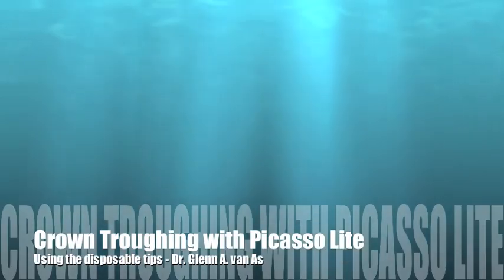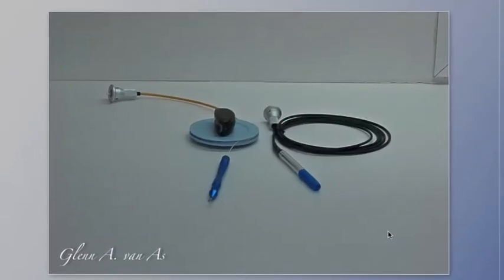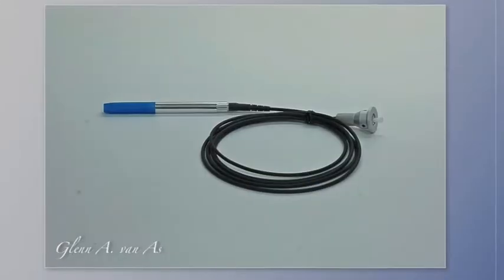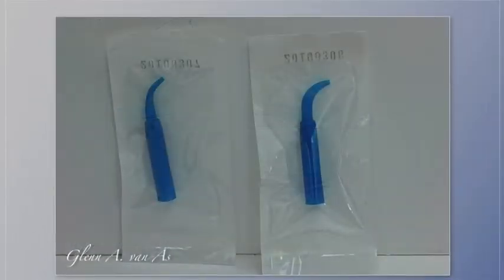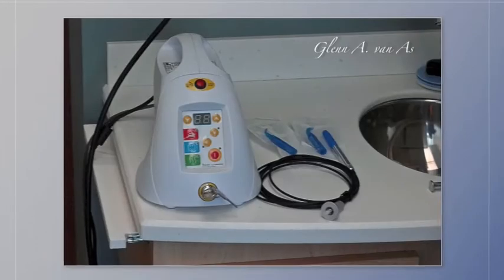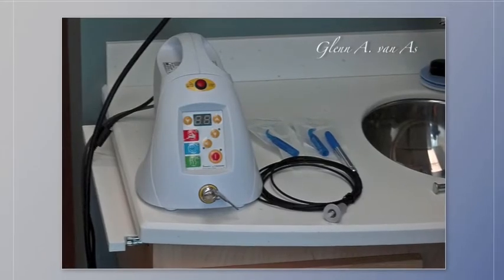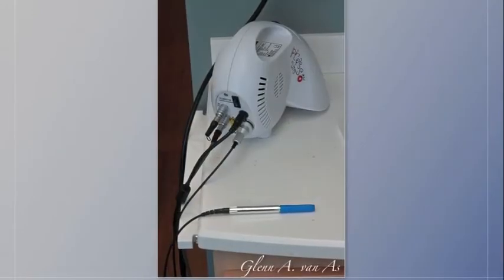In this video, we're going to see how the new disposable tips for the Picasso Light can be used for crown troughing. You can see the two fibers. The disposable tips are on the right-hand side, and here's the fiber optic cable with a blue cover cap. The tips come in 90 degrees on the right, 45 on the left, and varying lengths. The Picasso Light unit is seen here with the tips and the fiber, which is plugged into the back of the unit.